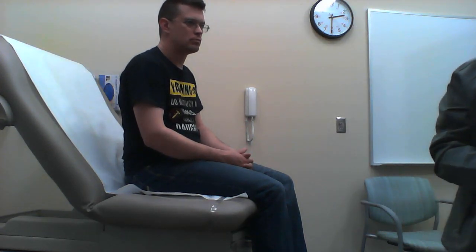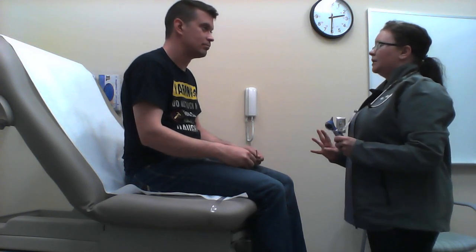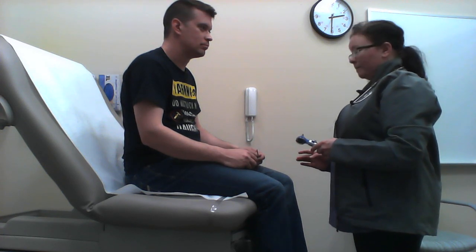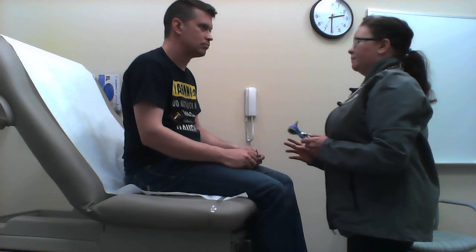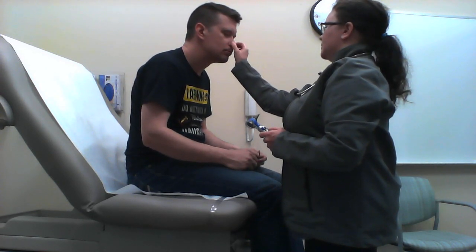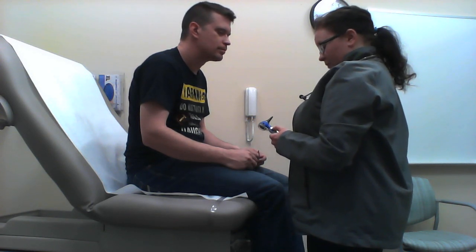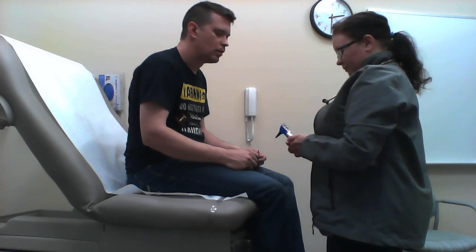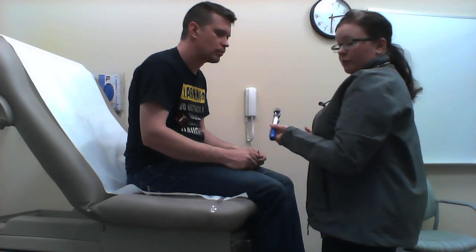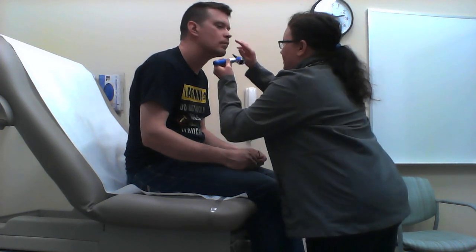I'm going to look at the outside of the nose. It looks normal. I don't see anything asymmetrical, any swelling, lumps, bumps. Next, I'm going to palpate, look for any signs of tenderness. Any of this hurts? Okay. I'm going to turn this on. And again, I'm only going to look at one side, but you would be looking at both sides. Now look inside the nose.